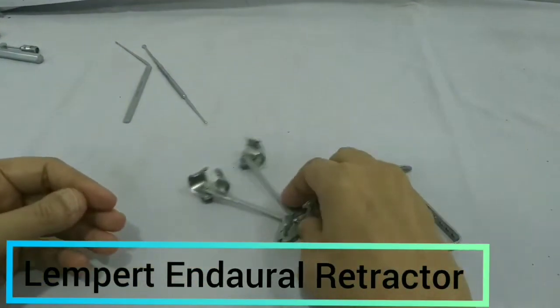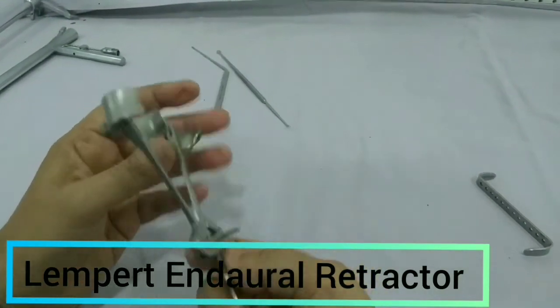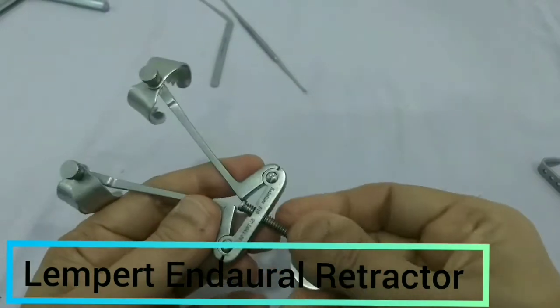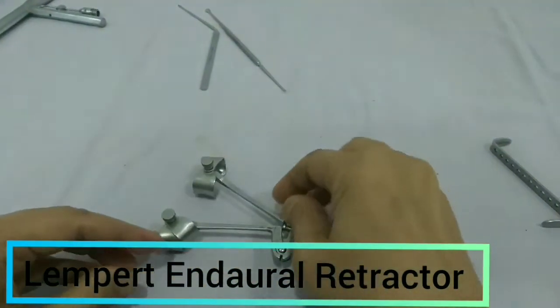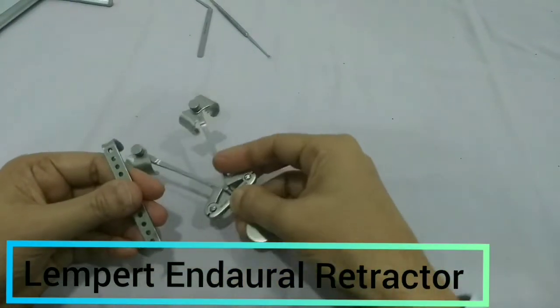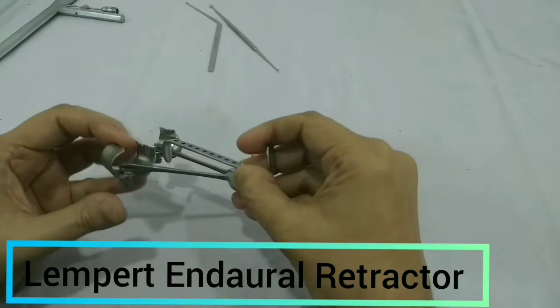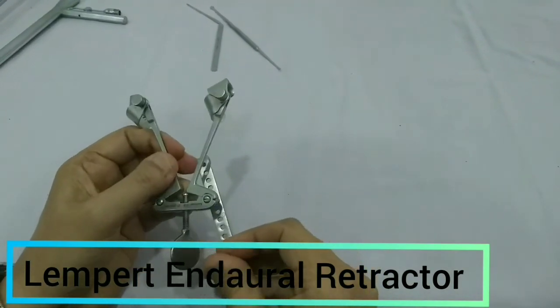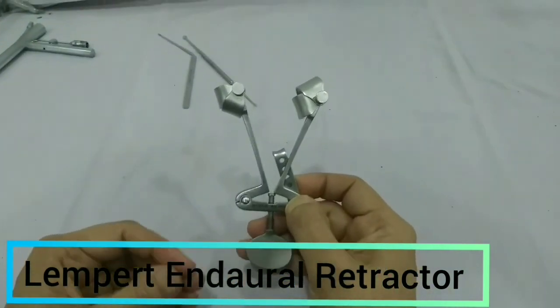This is another type of retractor used in mastoid surgery. You can see this screw — if you open the screw, the gap increases. These two ends will separate and keep the two flaps apart. To close it, we rotate the screw back. Sometimes superiorly structures come in the way, so it has a third prong that can be passed superiorly to reflect and retract the temporal fascia. We can adjust its size as needed. This is the third blade — two main plates plus the third one — and this is used in mastoid surgery.